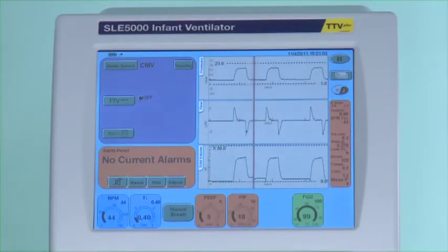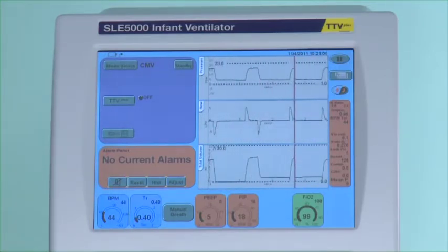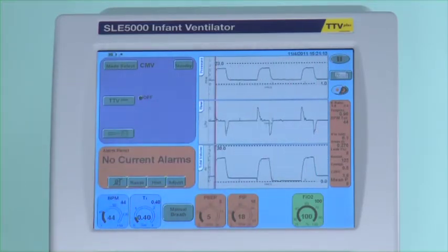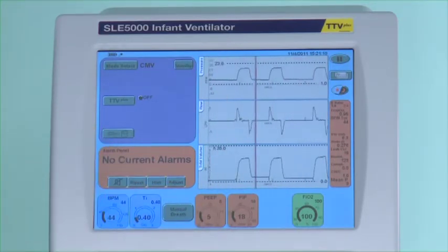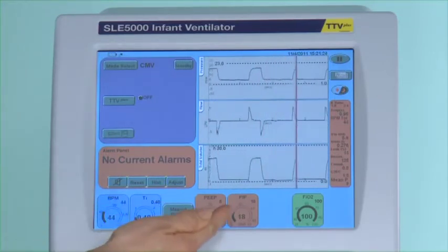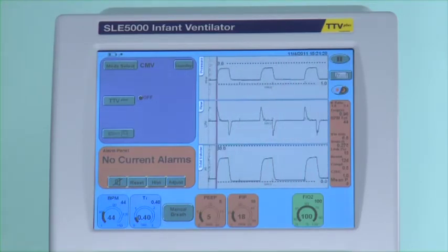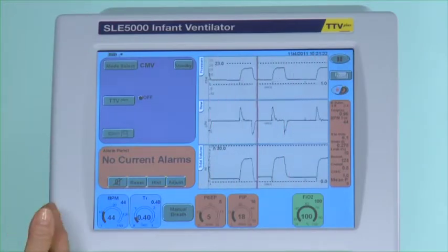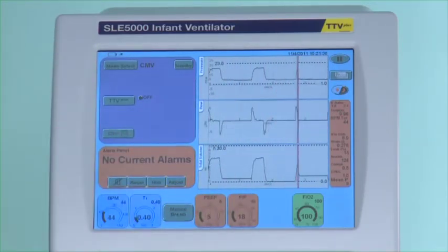Back to the mode of CMV itself. Looking at resistance and compliance will indicate what needs to be done with the peak inspired pressure. If resistance increases you need more pressure. If resistance decreases and compliance increases you need less pressure. Somebody then has to be in front of the monitor looking at the resistance and compliance and adjusting the peak inspired pressure accordingly.